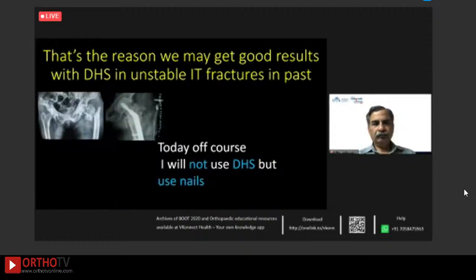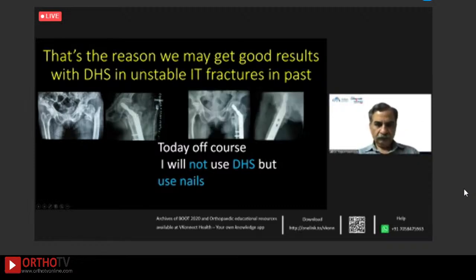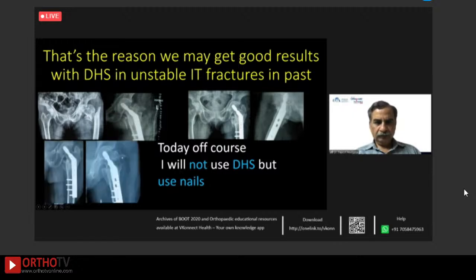So that's the reason why, even in the good old days, if you could achieve an anterior medial stability, as you can see here, today people will, as I said, throw a fit if this is done. And again, even I would not do this. I would do a nailing in this case with a good anterior medial stability. But this was done almost 18 years ago. And as you can see here, the fracture has started consolidating. And this is at 1 year, absolutely consolidated fracture.